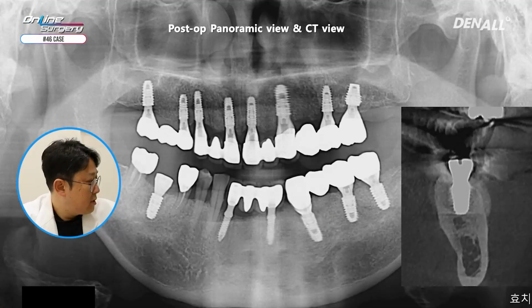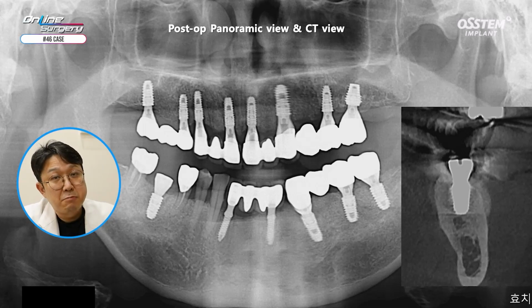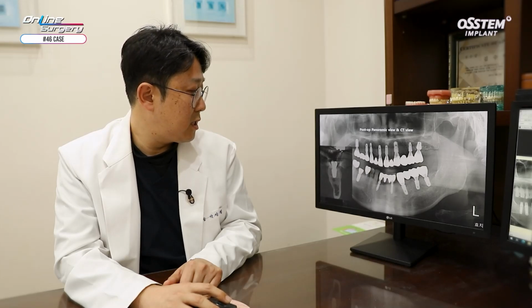This is the post-op photo, panorama image, showing the implant position in terms of vertical and horizontal position. The position looks okay. For vertical implant positioning, without performing bone grafting, the implant can be placed a little bit deeper, to put the implant more in bone. It would be placed 1 millimeter or more deeper, or by one thread. It would not pose a problem. However, I don't like to place an implant unnecessarily deep. The position looks okay on the image.